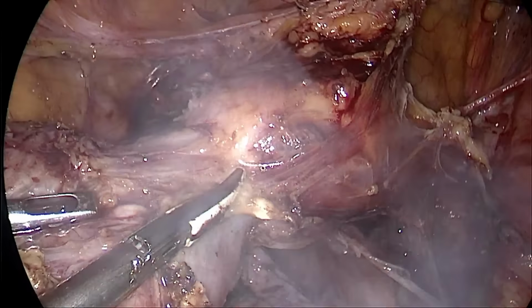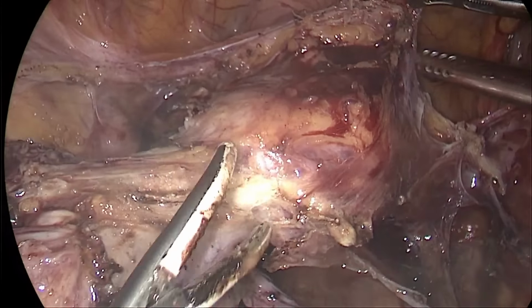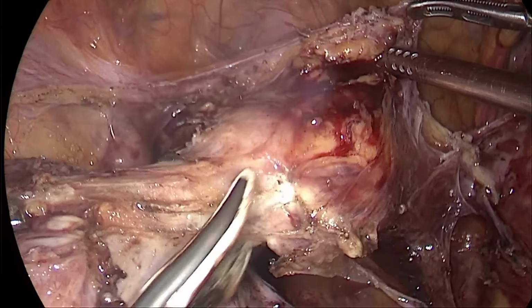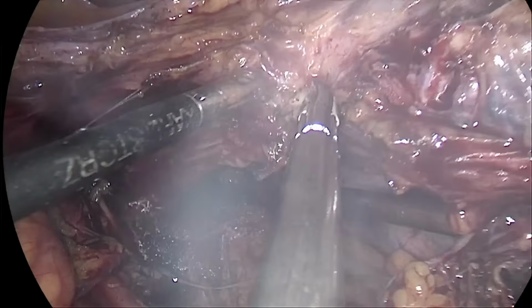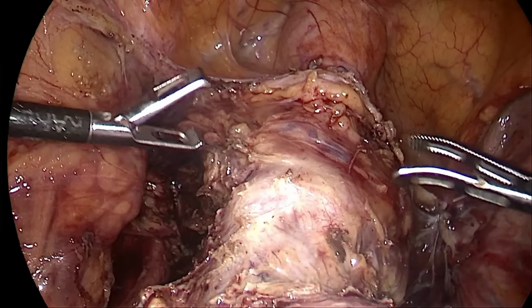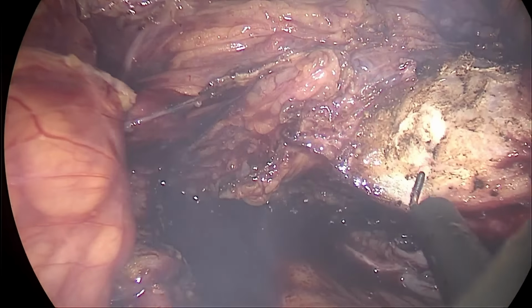Coming back to the uterine on the right side, that's the uterine pedicle, duly coagulated. So finally uterine is taken, and also some part of the Macken rod on the left side. So now for the opening of the vault, we are using a sponge stick from down below through the vagina.